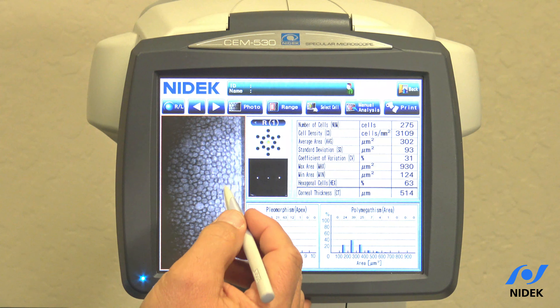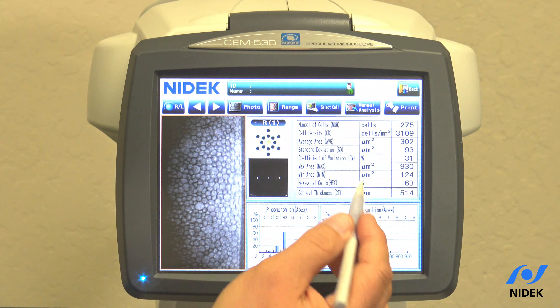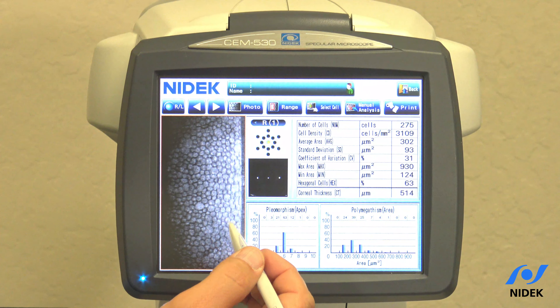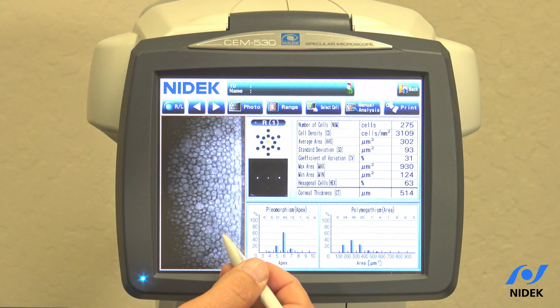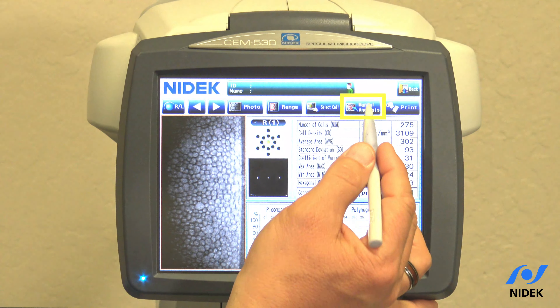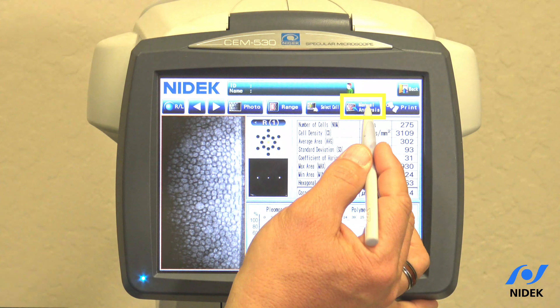If you're not happy with the auto-analyzed results, or if you cannot obtain automatic analyzed results, we can go into manual analysis. In manual analysis we utilize the center point mode. Center point means I have to select in the center of each cell. The software will not analyze a cell until it is completely surrounded.